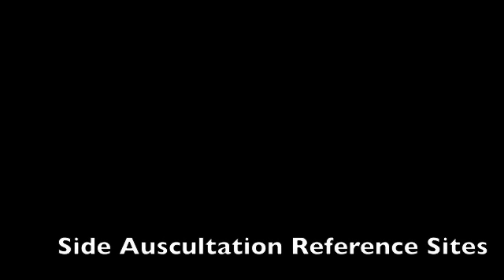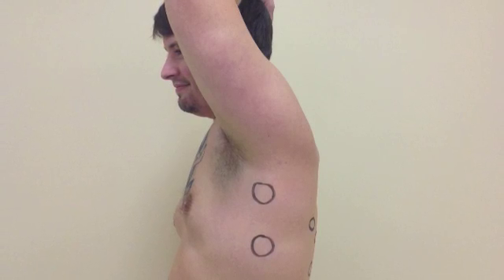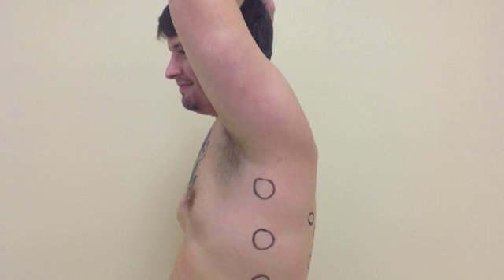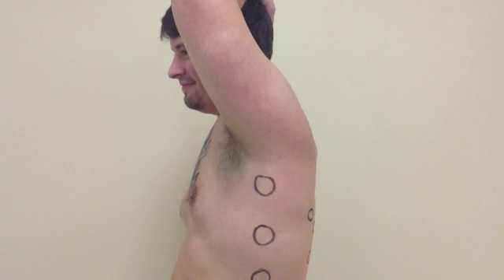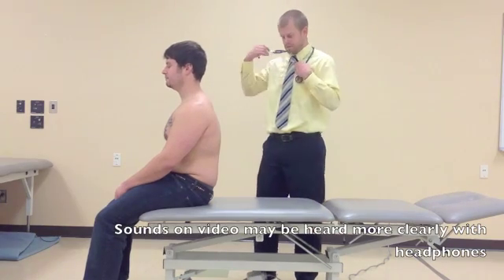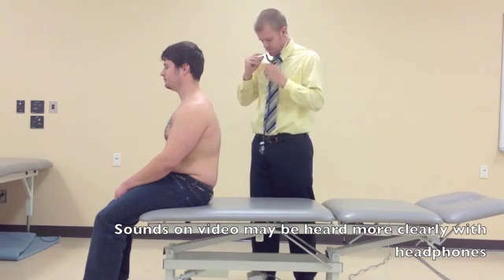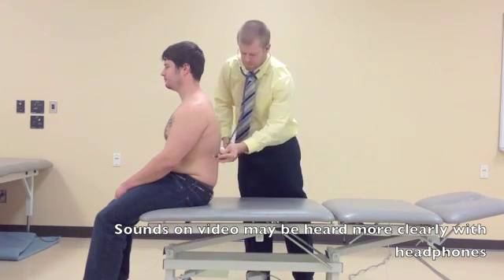This segment will cover auscultation of the sides of the lungs. Possible auscultation sites for the side of the lung are pictured here. Ribs should be avoided and intercostal spaces should be your target for listening. Three spaces should be listened to going from side to side to compare, listening for one complete respiratory cycle. Here is a normal vesicular sound.